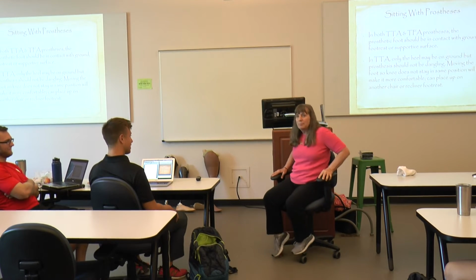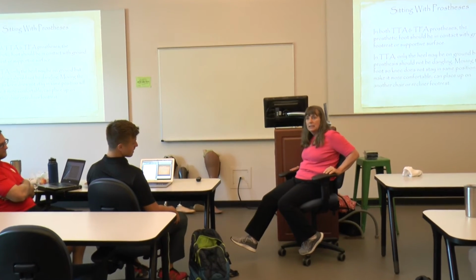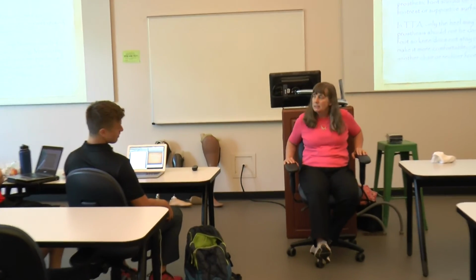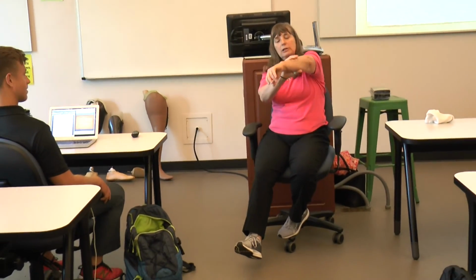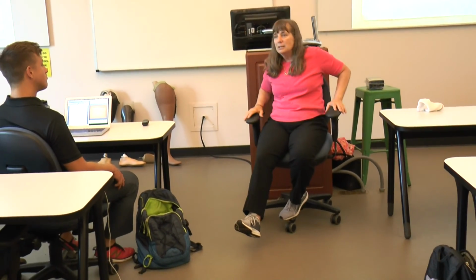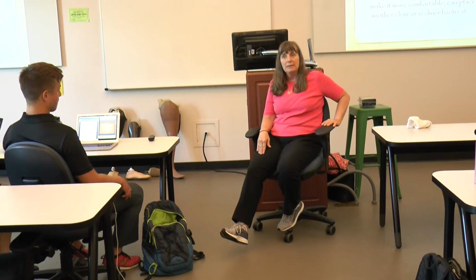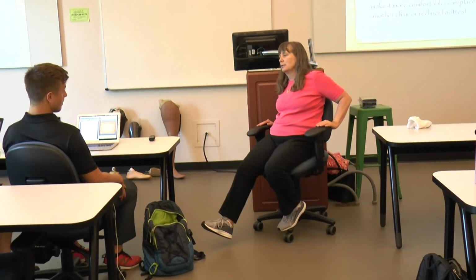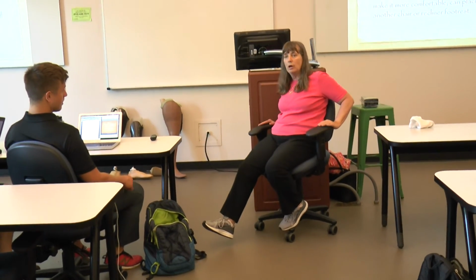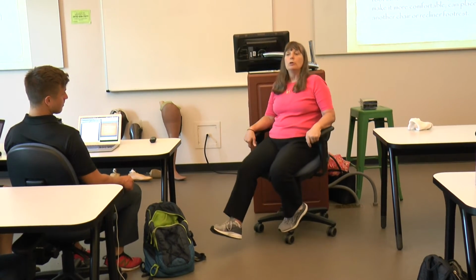Okay, so if this is my prosthesis, I can't have it dangling like this. The weight of my prosthesis hanging like this catches in my skin, and it actually fulcrums over the end of that bone and makes the end of the bone hurt, if I'm transtibial. If I'm transfemoral, it does the same thing and fulcrums over the end of the femur. Sitting around for long periods of time, I tell them 5 to 10 minutes on the back, well, it's not a problem, but sitting for long periods without the foot at least supported will actually make your limb sore.